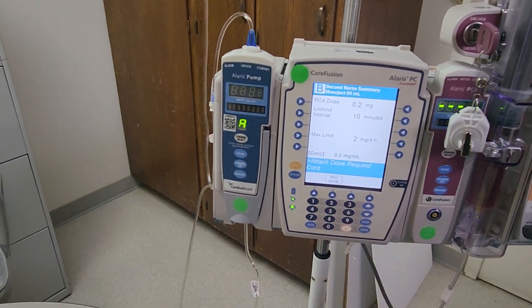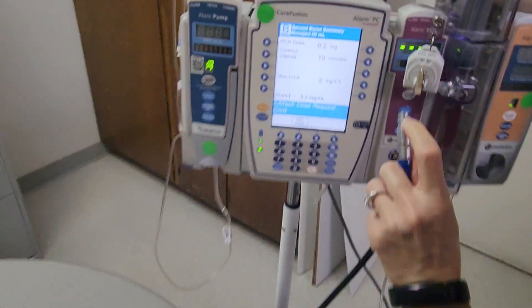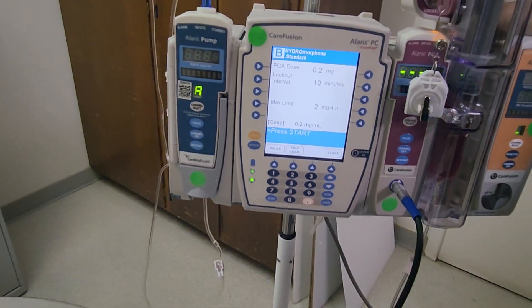Attach the dose request cord. The PCA patient-controlled button has a red dot that needs to match up to the red dot on the front panel.